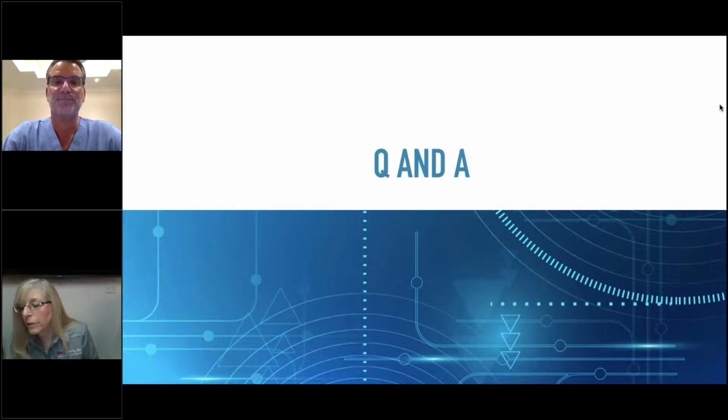Okay, the next question from our viewers. We're having so many questions. This is very exciting. What is your rate of overextrusion of GP with your technique, understanding that you do try to compensate for this by cutting the cone short?